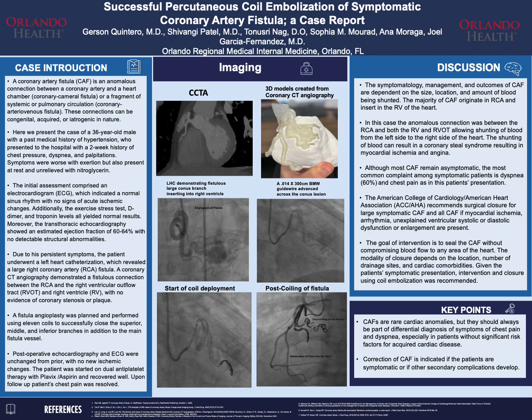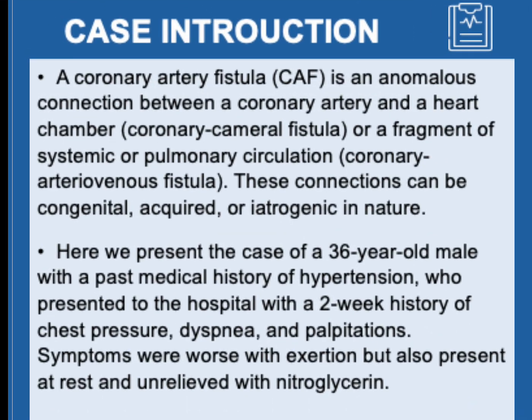Successful percutaneous coil embolization of symptomatic coronary artery fistula, a case report. A coronary artery fistula is an anomalous connection between a coronary artery and a heart chamber or a fragment of systemic or pulmonary circulation. These connections can be congenital, acquired, or iatrogenic in nature.